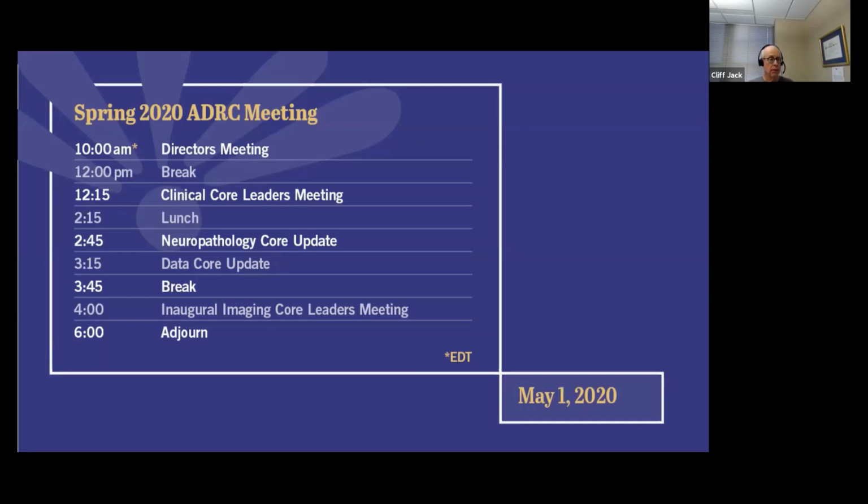But again, we don't think that 10 minutes of acquisition using the specific ADNI standards is going to be a significant impediment to innovation. Why, next, Ranjan, why would you not include T2 star GRE and a diffusion sequence among the mandatory sequences? Should we not always try to identify microhemorrhages in vascular disease and recent infarcts?